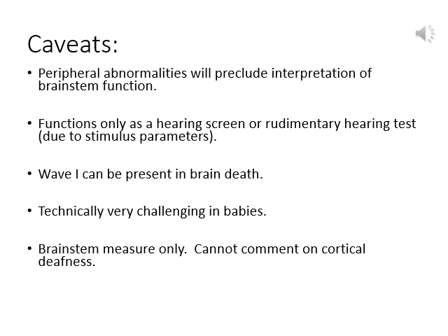And please note that the wave 1 may be seen in brain death. The wave 1 is generated by the 8th nerve and is therefore a nerve response, which can be activated even when the patient is brain dead. The later waveforms, from wave 3 onwards, will not be seen in brain death as they are measures of brainstem function.